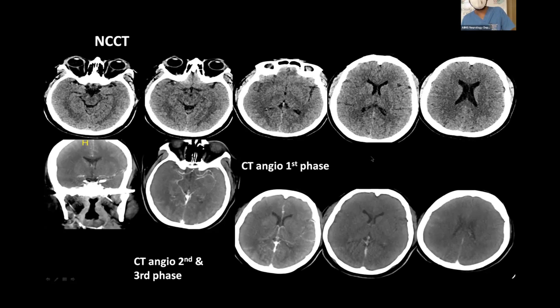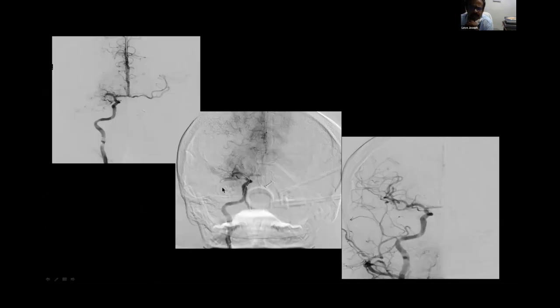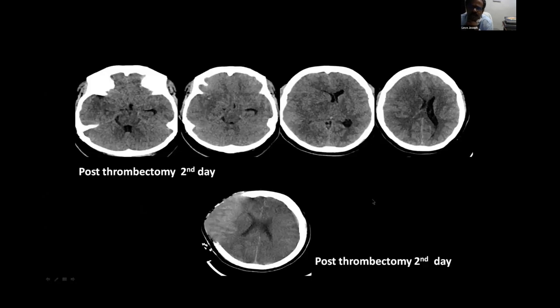Yes, sir. In some young patients, this case was 3 years back, we have pressure to try to intervene. Even after successful recanalization, as you exactly predicted, there was some hemorrhagic transformation and this patient required craniectomy. Though we are not sure whether we benefited the patient or not, the patient survived.